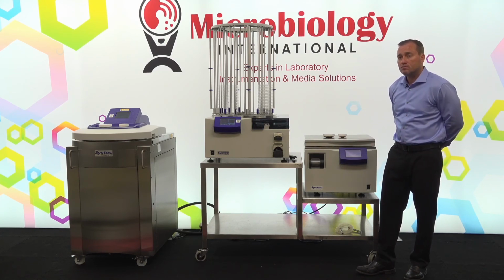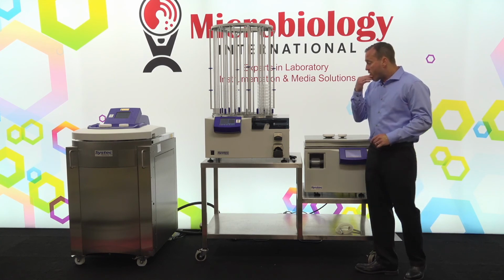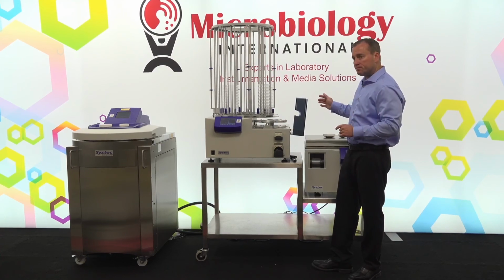Sounds good. For the MediaFill and the plates, if we have a plate labeler, is that able to be included at the same time? Yes, it is. So there is an ability to add. Could you zoom in for me, please?